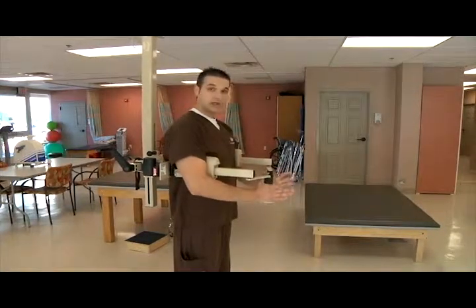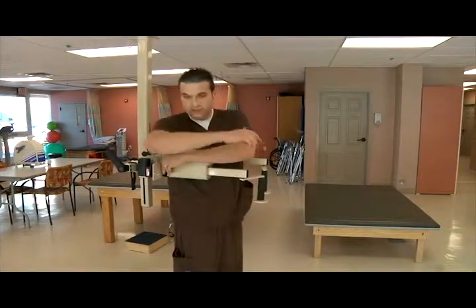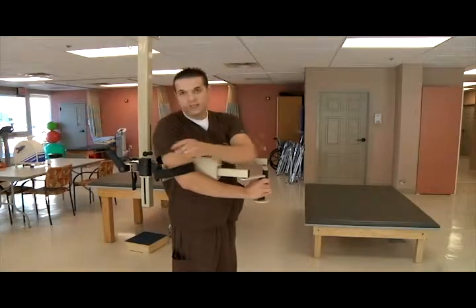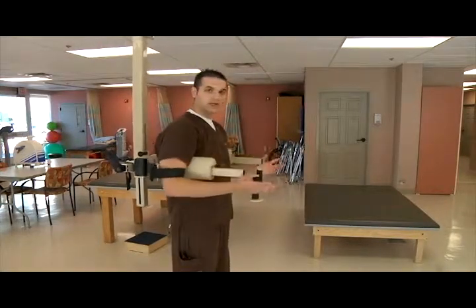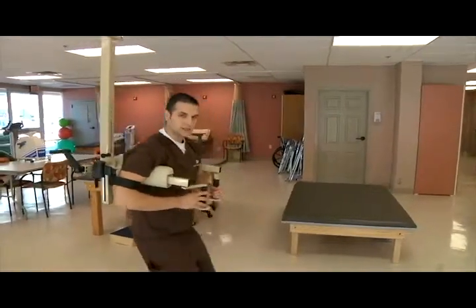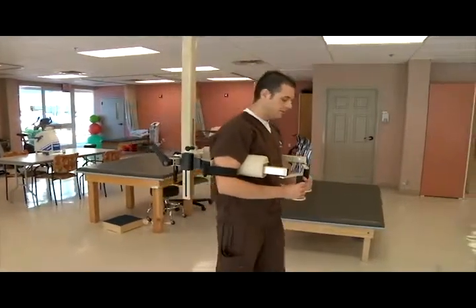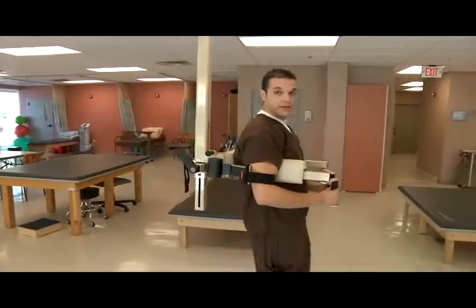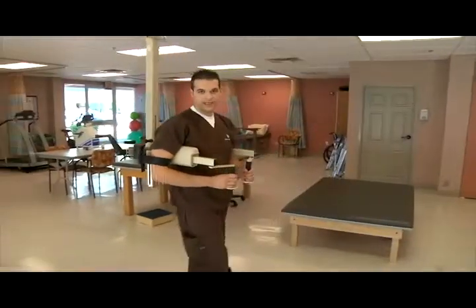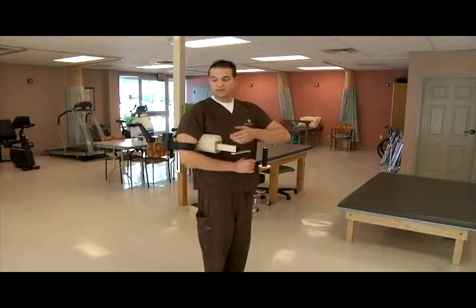Once the patient's nice and secure inside the device, what we now need to do is the very last piece, which is make it completely secure by using the belts and locking those in. The patient's now ready to go. They can put all of their weight into the device. If they fall, it's going to catch them, and then they can start just moving forward and begin gait training. Okay? As a therapist, I'm able to stand 15, 20 feet away, 30 feet away if I'd like, to help gait train these patients. So now we're going to go ahead and take the patient out of the device.